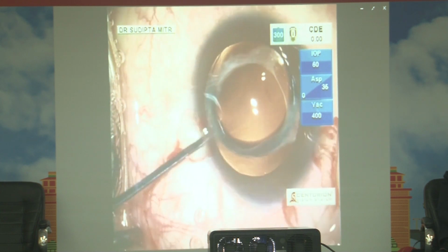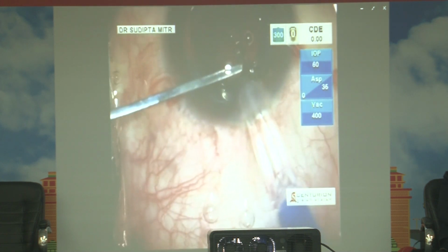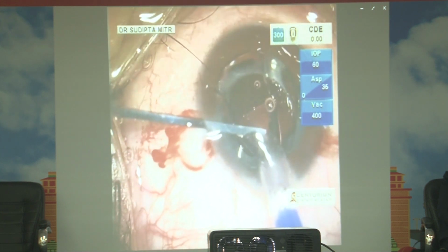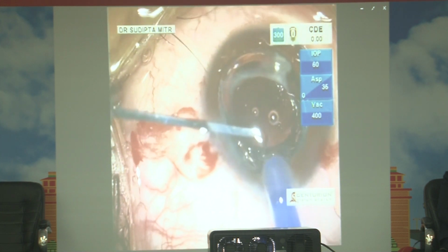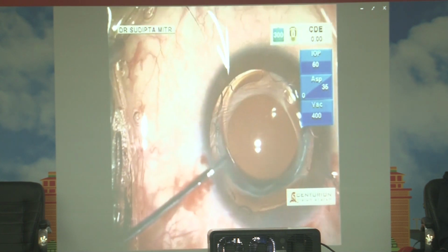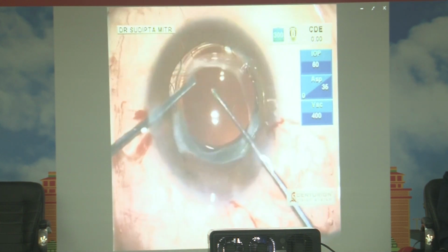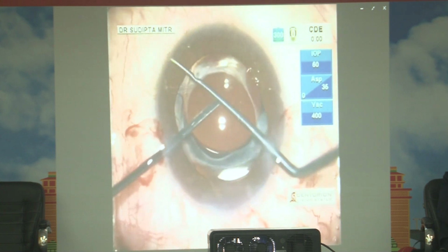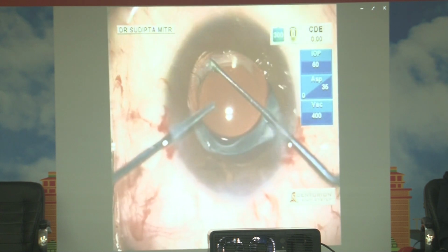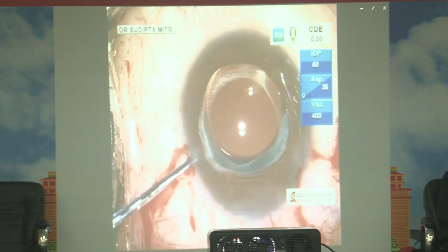I learned with time that it's better to do it with injection. I mean peribulbar, it stabilizes and causes less pain. You have to have a very stable anterior chamber, good viscoelastics guiding your lens. Tumbling of this lens is really difficult. So it's better to guide the lens, go slow, look out for the proper notch if it is well placed, tucking the IOL, and be very careful not to put it in the bag, because this is for the sulcus. Sometimes while tucking, it's very flexible, and it goes in the bag itself, so then it's a big problem again.